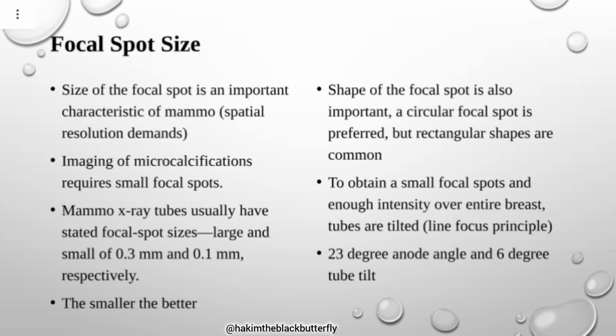Focus spot size. The size of the focus spot is an important characteristic of mammo because focus spot size determines the spatial resolution. I told you that in conventional radiography, if you want a high resolution image, you always choose a smaller one. Even in mammography, you have two focus spots, one of 0.1 millimeters and another of 0.3 millimeters.